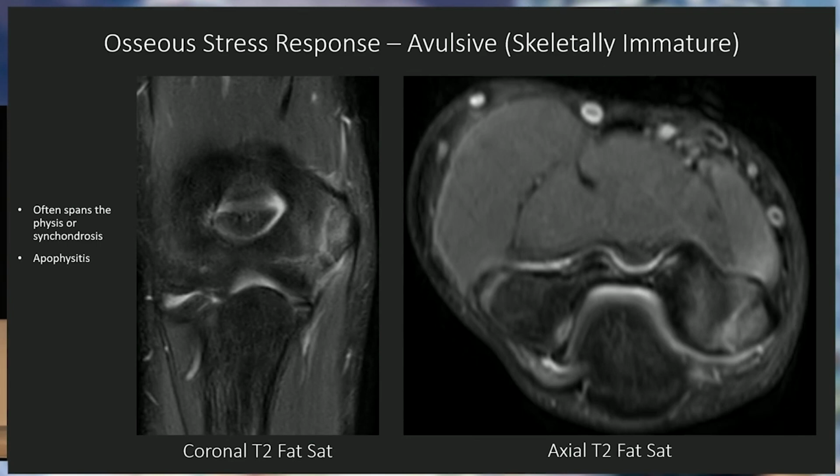So essentially along the inferior pubic ramus, there's an area in kids where the synchondrosis, or the cartilage interface between two areas of bone that are not completely ossified yet, forms irregularly, and it happens all the time. And it gets called an inferior pubic ramus fracture. But you'll get them in patients that have no risk factors for that.